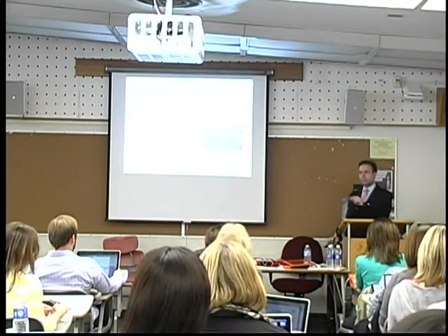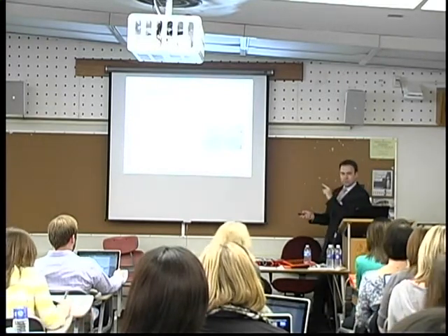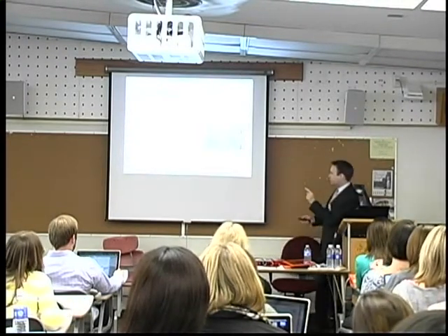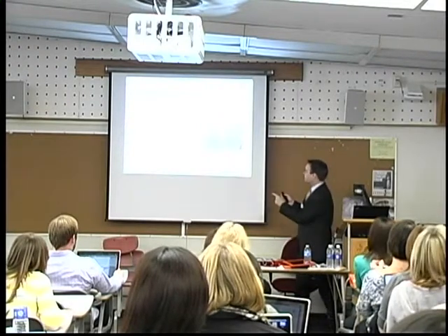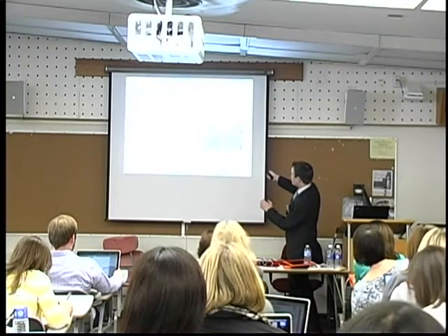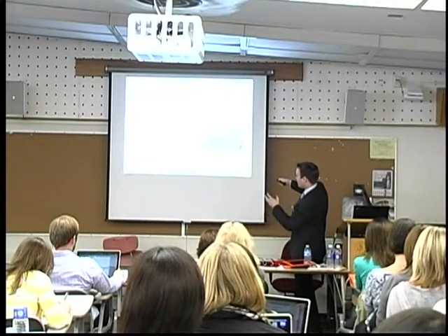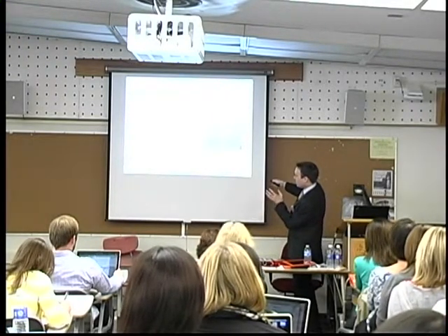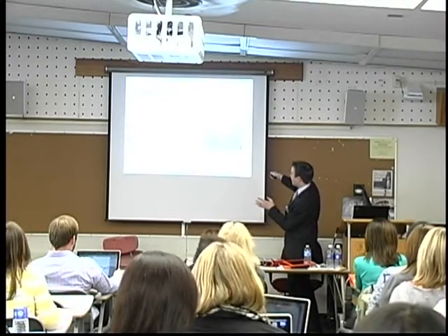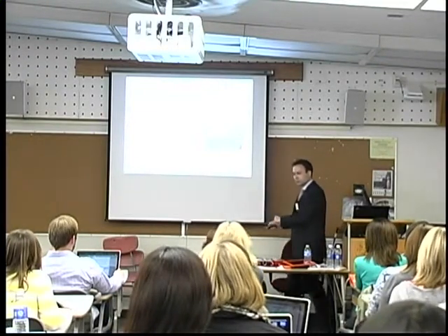We'll talk about this a little more in depth later on, but for right now, understand that in autism, one of the larger cognitive and processing impairments is that it is very difficult for the autistic learner to filter out the salient stimuli from a sensory-rich environment. So on this screen, there's so much going on, it's very busy, that the learner with autism might have tremendous difficulty telling that this is just the background and that these are some of the symbols that actually do something in terms of generating speech output. Okay?